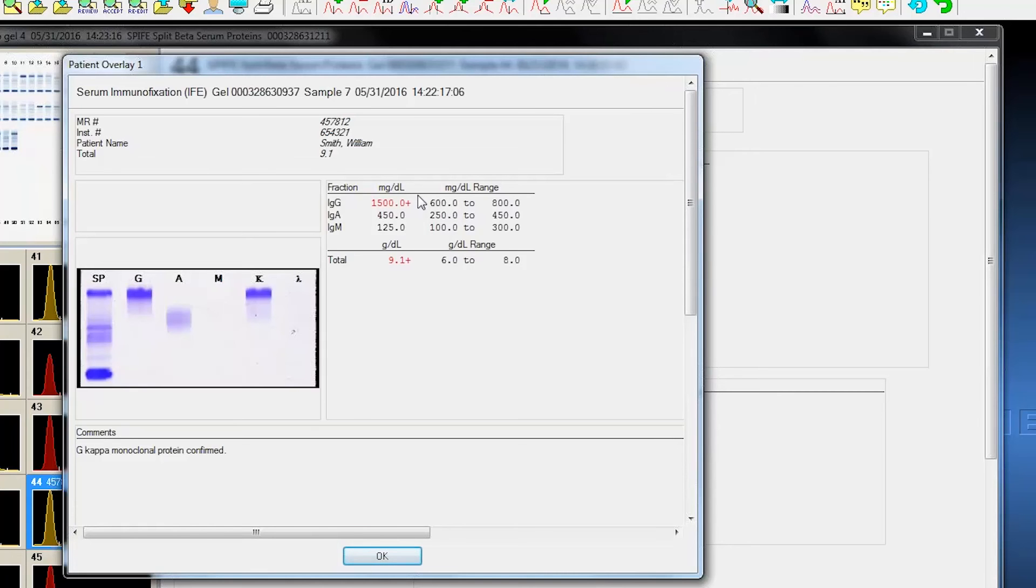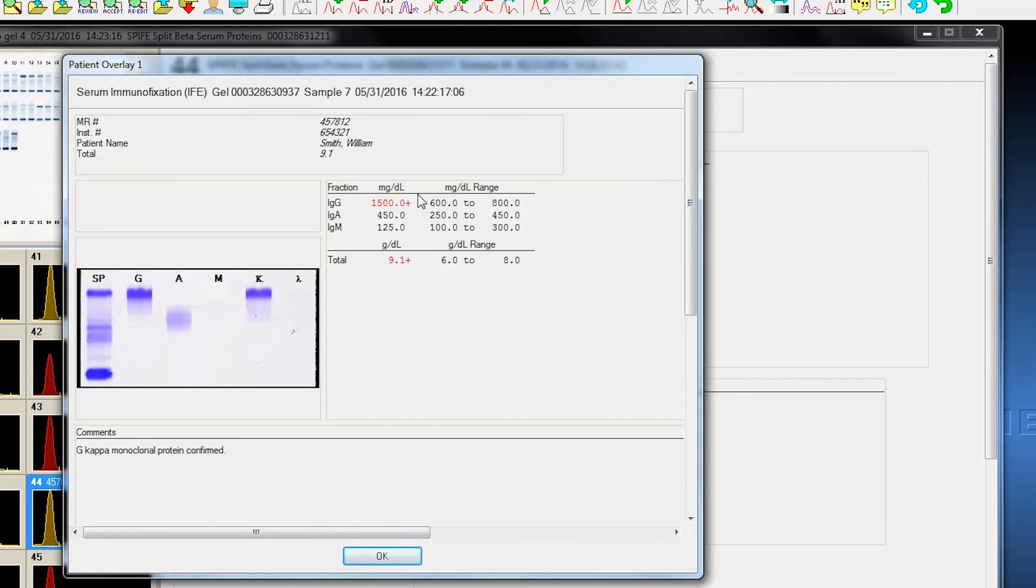And most importantly, I can look at this data here. If the immunoglobulin values, N-kappa, lambda, free kappa, free lambda, if those values are resident in the LIS, they can be downloaded as part of the data that the pathologist or whoever does the review, it gives them additional information.